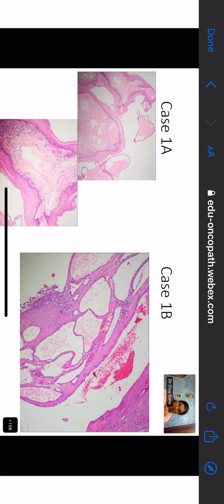I see. Okay, Suveta, now you've heard both Vimi as well as Dia. Yes, ma'am. Very good. So now do you agree with both of them or you disagree with either of them or what? I don't think it is a secretion, ma'am. It is just a eosinophilic material. You think it's a material, not a secretion. Yes, ma'am. Very good. So now let us come to a discussion of what is a secretion.